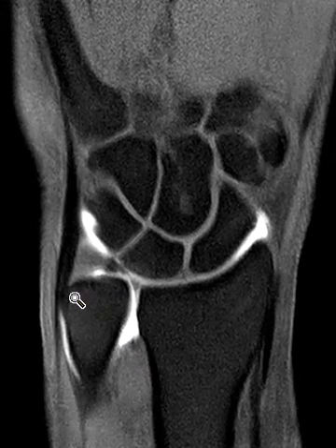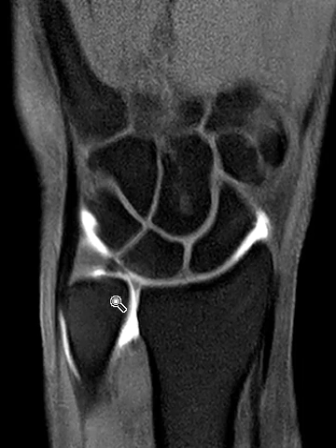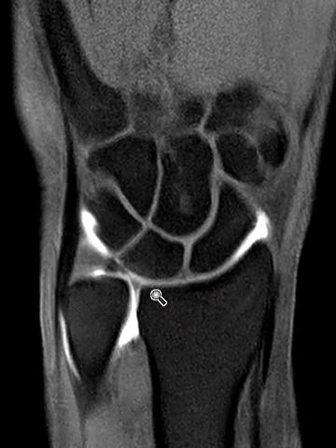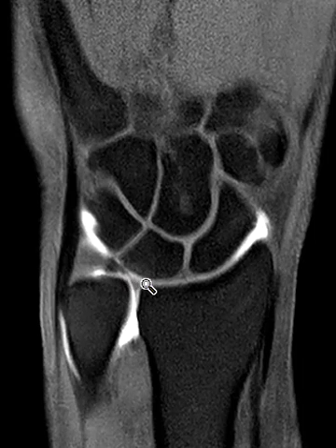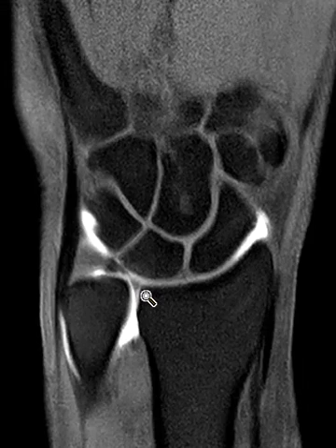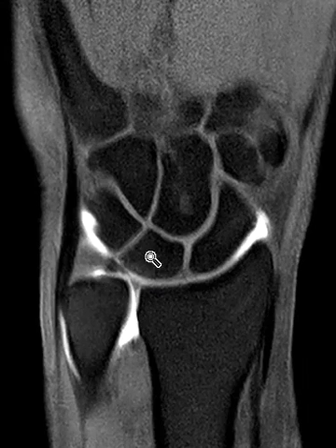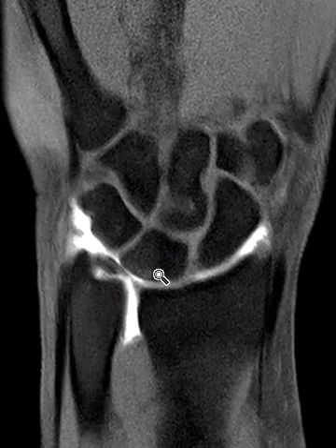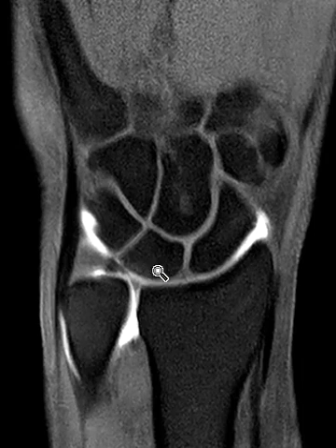There's one other thing to consider here. This is the distal ulna — normally the ulna will be a little bit proximal to the distal radius, but you can see it's right at the level of the radial articular surface, so this is a mildly positive ulnar variance. When you have a positive ulnar variance, there's narrowing right here where the TFCC goes, and what happens is the ulna can abut the base of the lunate bone here and pinch the triangular fibrocartilage.